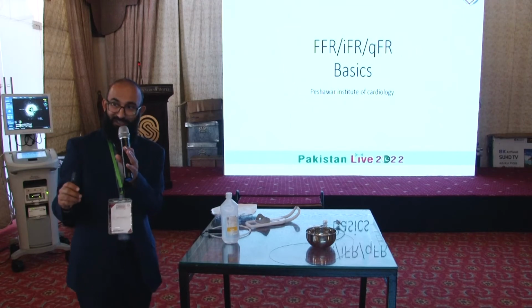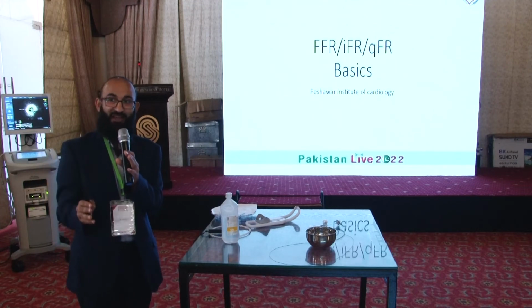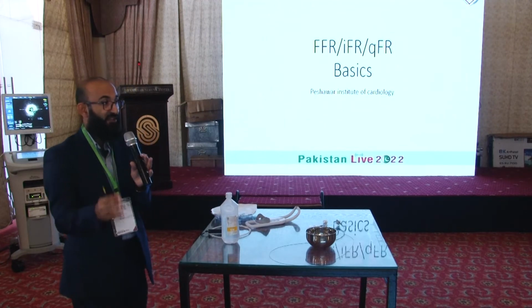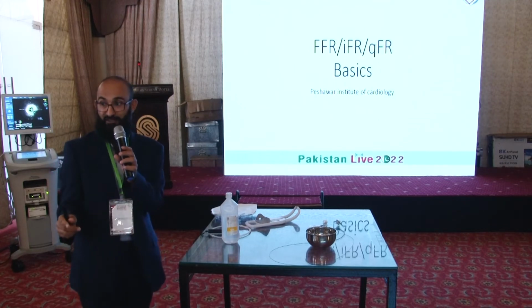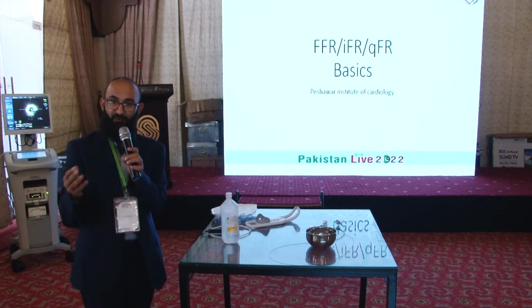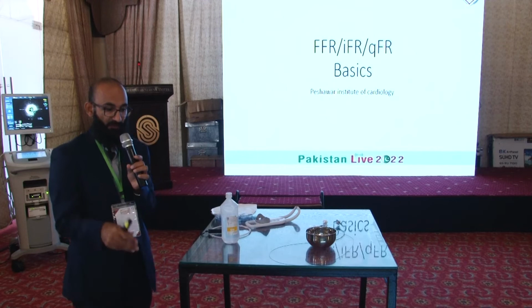We don't just need to see the lesion and stent it. Sometimes we don't want to treat it if it is not ischemic. Because there is 15-year data showing event-free survival if it is not physiologically significant. And we know from a lot of trials that the annual mortality, if it's less ischemic, is very low. So that's why it's very important to incorporate these tools into the practice.